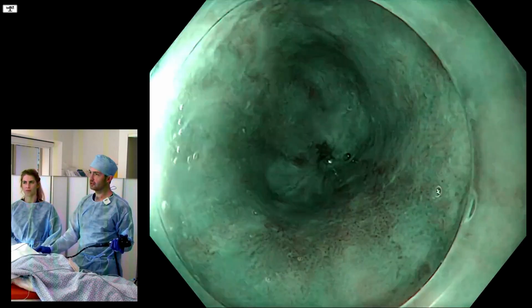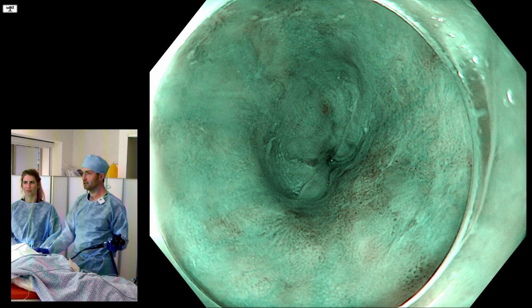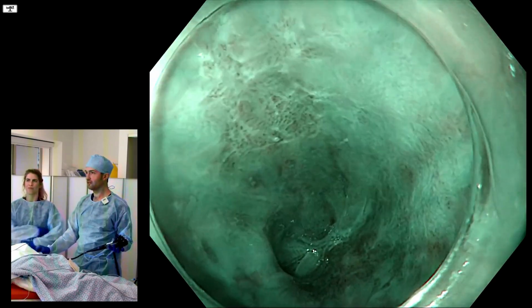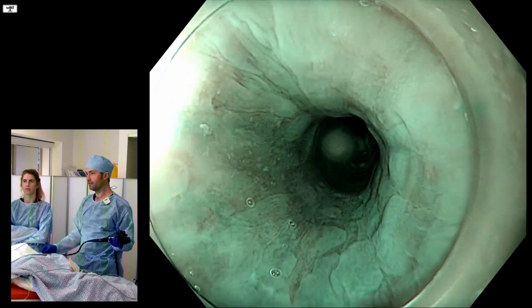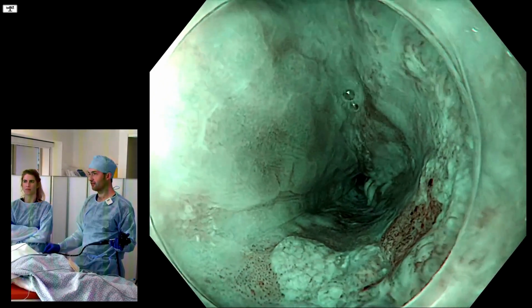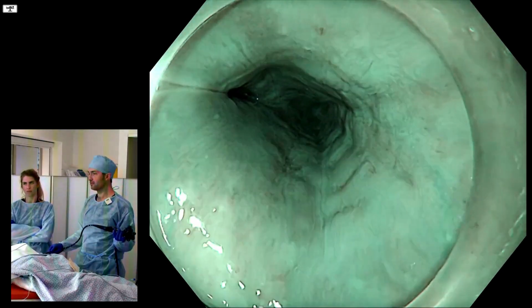It looks a little bit maybe bumpy. It looks a little bit nodular. There's maybe, when you look in the background, some kind of surface adherent fibrin indicating that potentially there's some inflammation there. And then as you come back more, you start to see more of the same. And then there's something very, very clear on narrowband imaging or virtual chromoendoscopy here, which was not visible easily in white light.